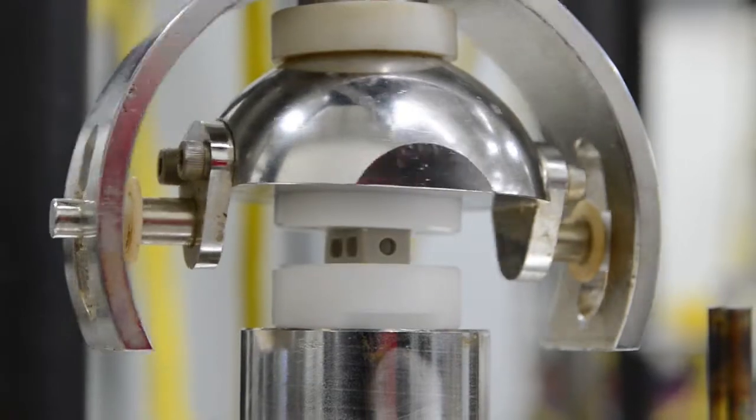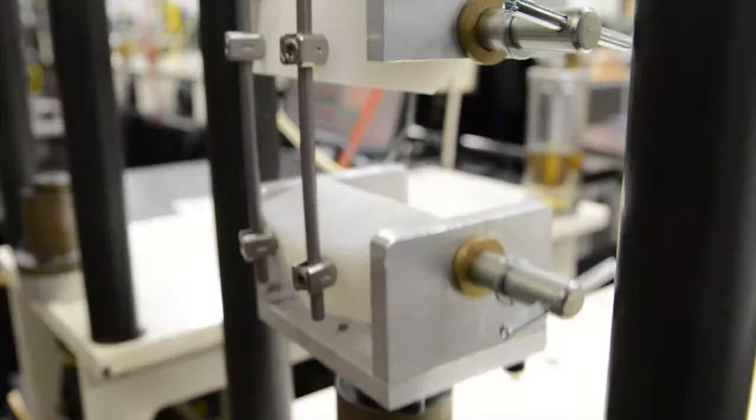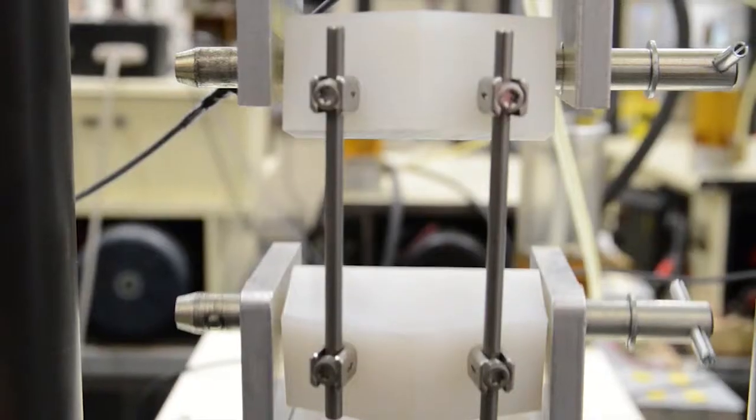We do a lot of spine testing at AccuTech. We test to both ASTM F1717 and F2077. For F1717 testing, we do static compression, static torsion, and dynamic compression testing. Those are the more common test methods.